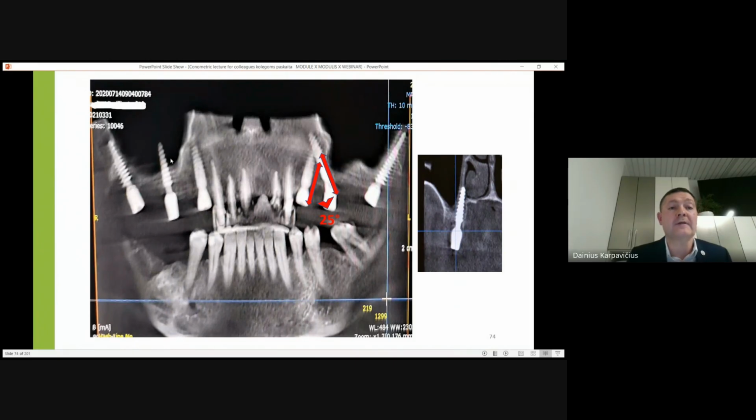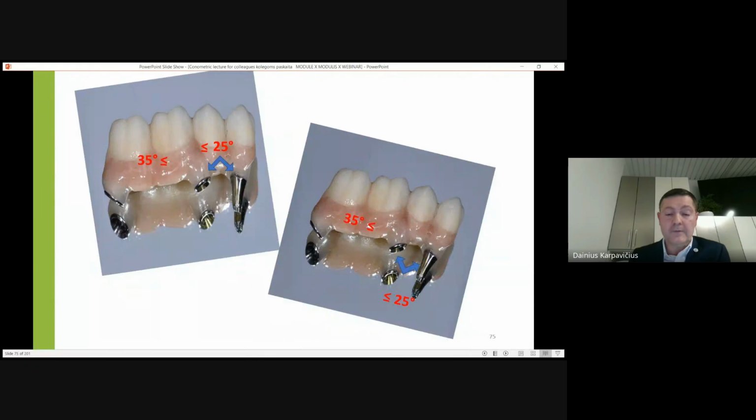On the first quarter, sometimes a doctor asks if it is in the sinus. So for this reason, I put a picture to show that no, this is in the palatal bone. But this is not our topic. I just know these comments sometimes come, so I said at once to make clear that this is not in the sinus.